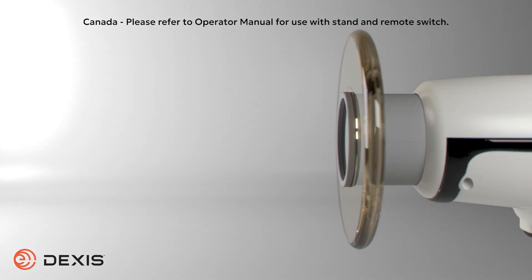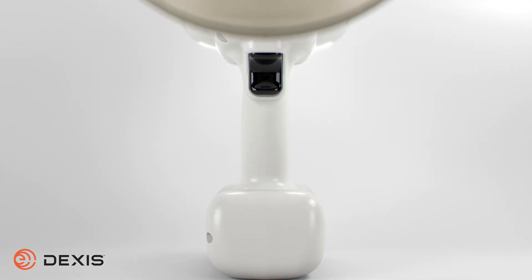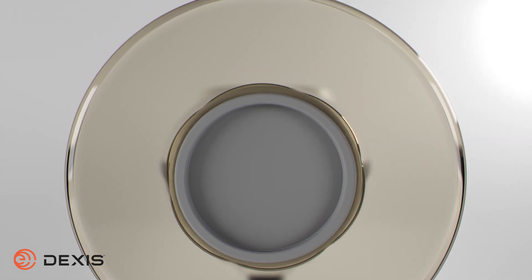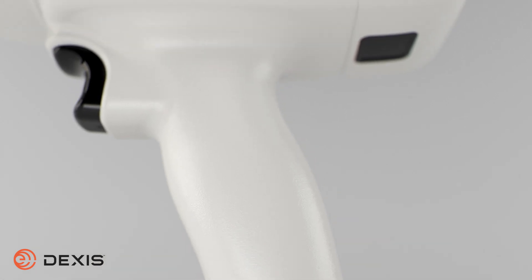Thank you for choosing the DEXAS Nomad Pro 2 as your x-ray solution. The purpose of this video is to familiarize you with the Nomad. This video covers how to operate the Nomad, along with techniques for safe handling. We recommend all staff view this video and read the manual in its entirety before using the Nomad.